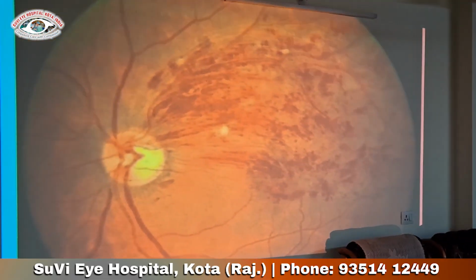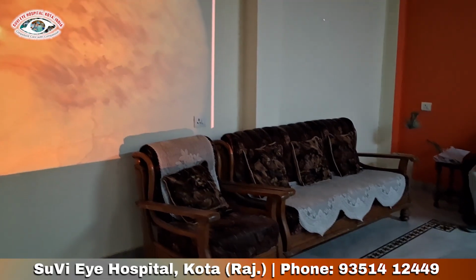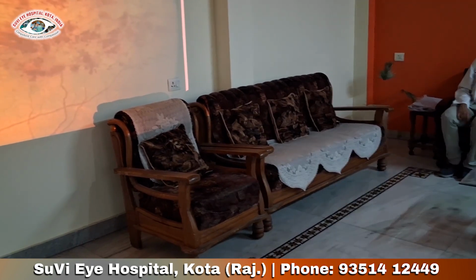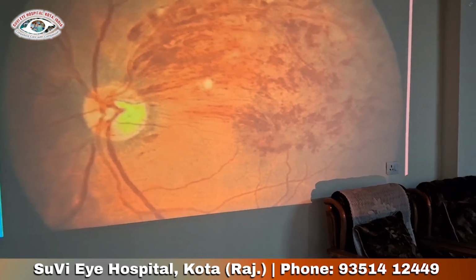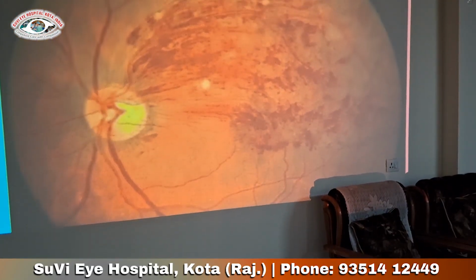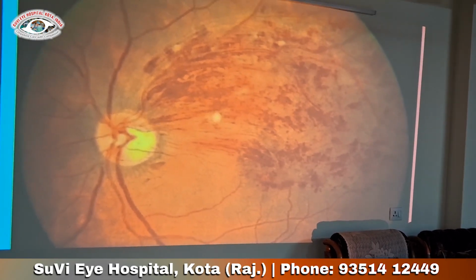This is the fundus picture of BRVO. We can see there are wedge-shaped, flame-shaped hemorrhages in the supratemporal quadrant. Why is the supratemporal quadrant affected more in BRVO? It is because there are more AV crossing points in that area.